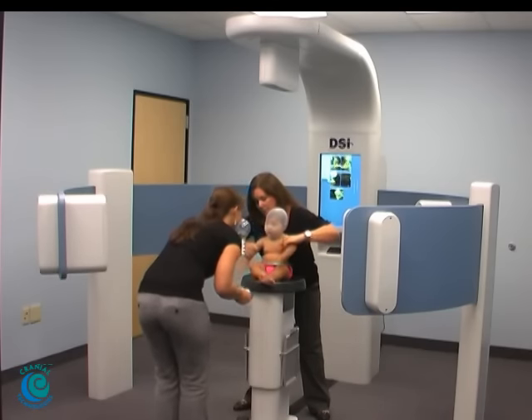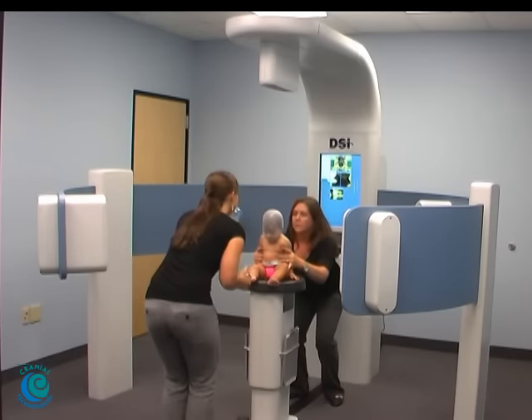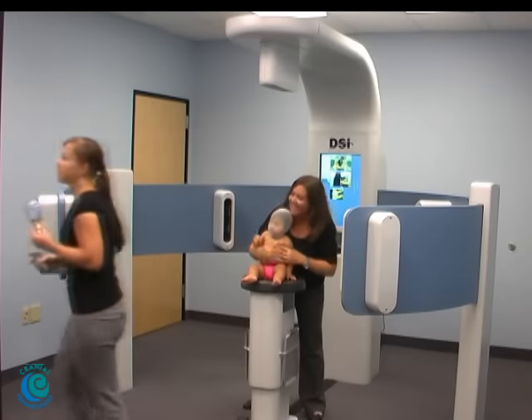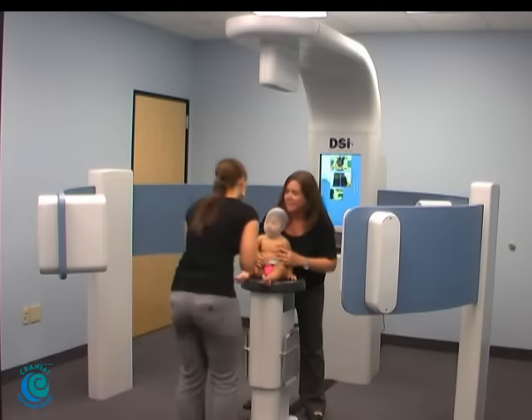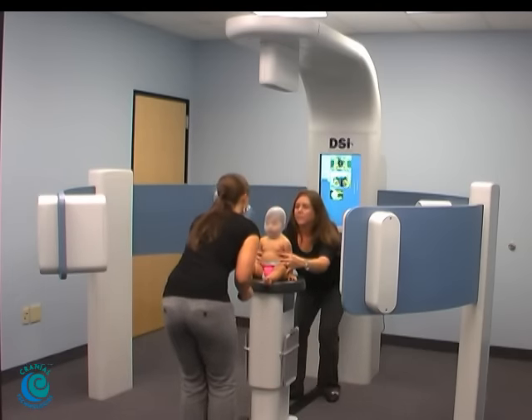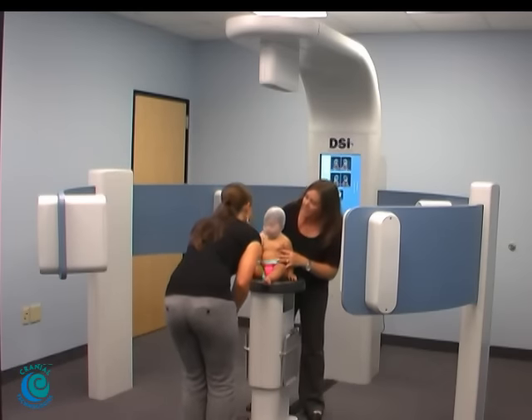Sophia, are you ready? Let's see, what's this? Sophia, you look down. Let's get another toy that makes noise. What's this? Sophia. There we go, that was a good one. Good job.